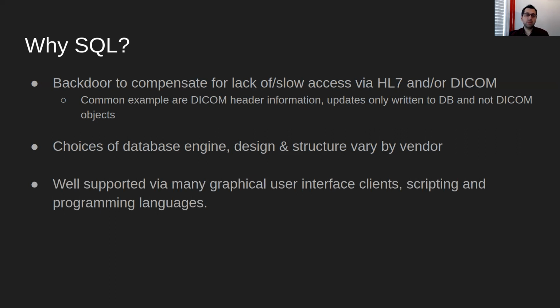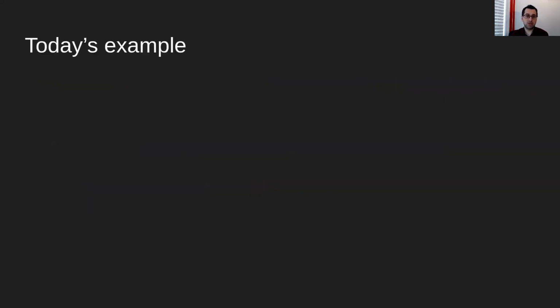The nice thing about SQL, though, at the end of the day, is that it's well supported, as I said, standard between the database engines, but also you have multiple choices for graphical user interfaces that you can use, as well as being able to write scripts against a SQL database in a variety of programming languages. And both here, like we're talking serious programming languages as well as scripting.